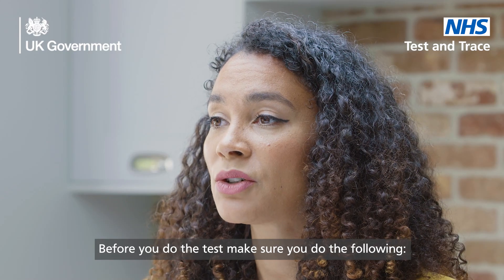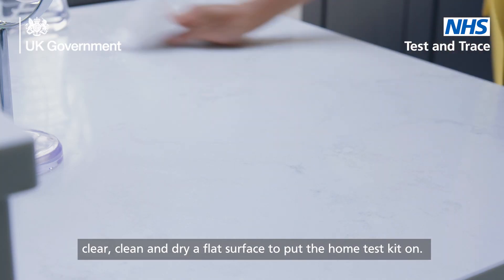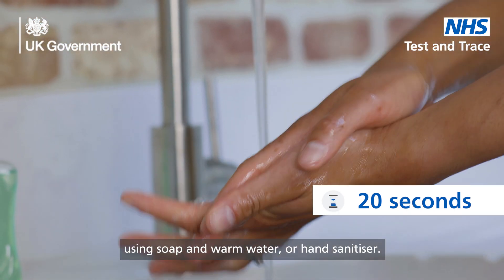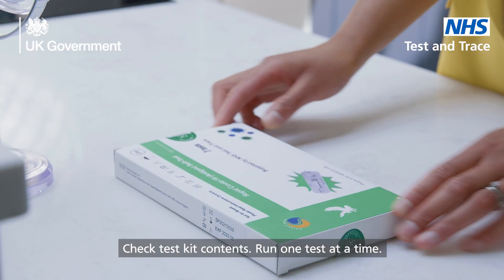Before you do the test, make sure you do the following. Immediately before performing the test, clear, clean and dry a flat surface to put the home test kit on. Wash your hands thoroughly for 20 seconds using soap and warm water or hand sanitizer. If you are helping a child or someone else, ensure they do the same.